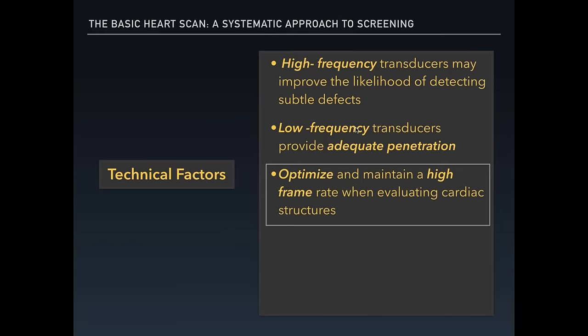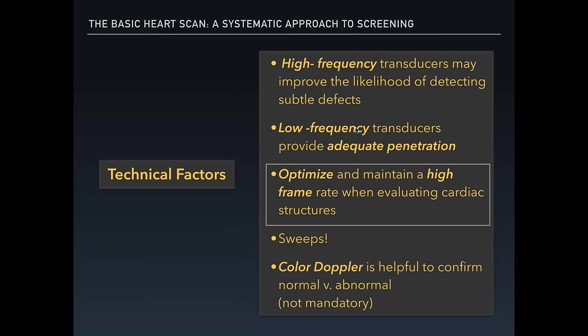You also want to keep in mind to optimize and consistently maintain a high frame rate when evaluating cardiac structures to obtain the best optimal imaging. Also, sweeps are highly recommended as you're able to evaluate fetal cardiac structures in real time. And color Doppler is very helpful to confirm normal versus abnormal, although it is not mandatory.